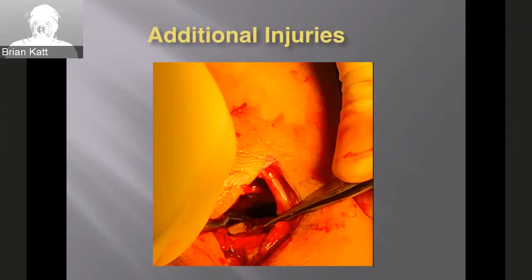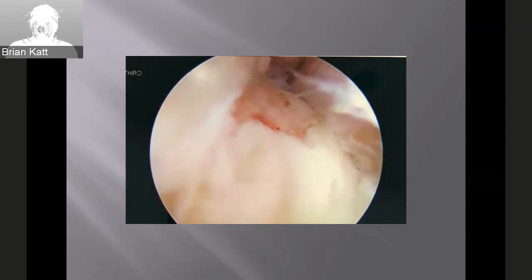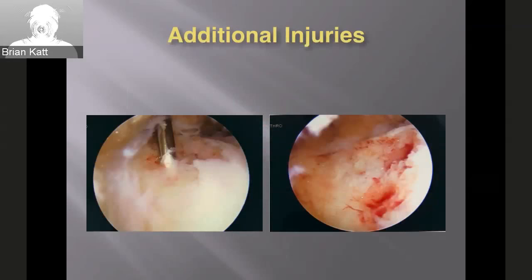And this is also a trimalleolar fracture that came in, fixing the medial mal. You could notice that there was a pretty significant injury to the talar dome that I was able to just microfracture with a dental pick at the time of fixing the medial fracture. And then he also had a syndesmotic injury, taking him back about 12 weeks after. Just put a scope in there just to see how the dome looked after the injury, and was able to microfracture it again just to see if we could improve his outcome long term.